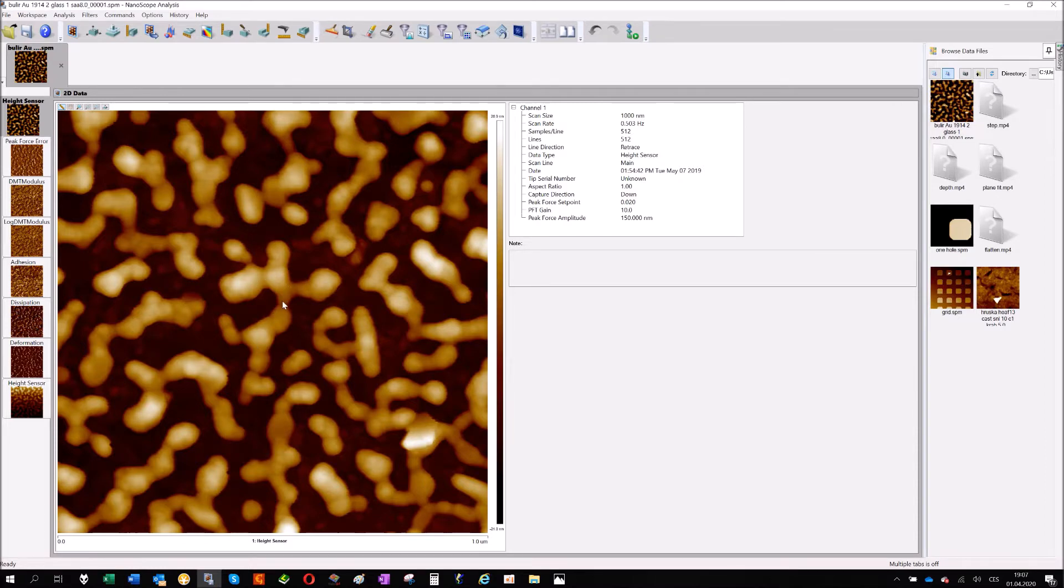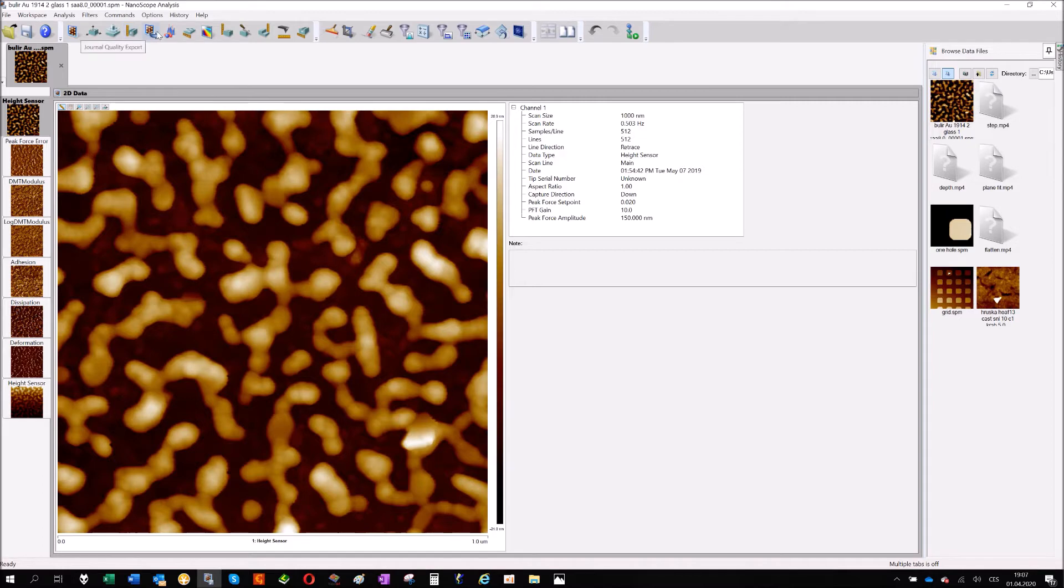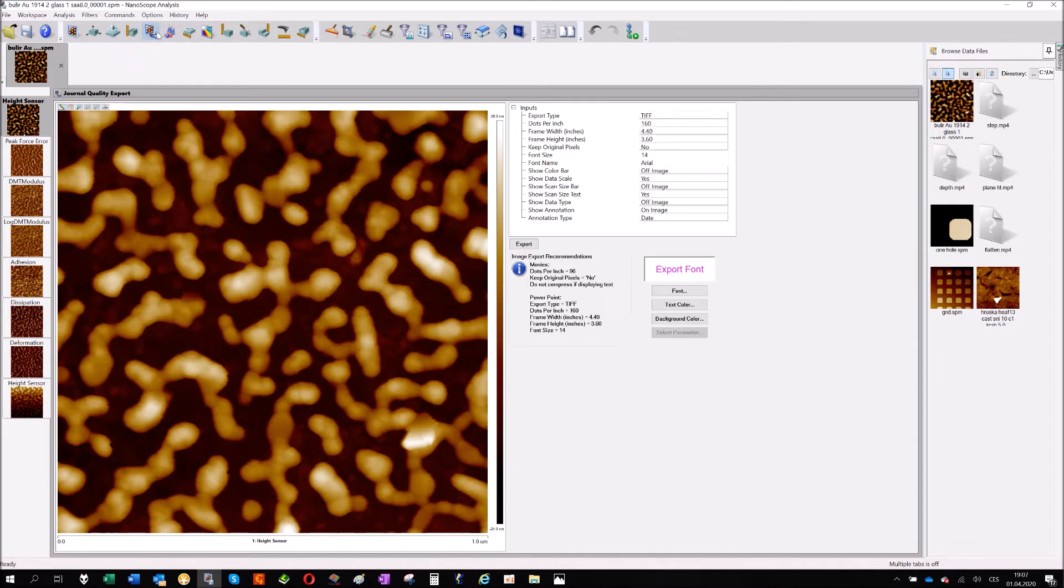So I leveled the image, and if you want to export it, we have a special button for that here. It's journal quality export.